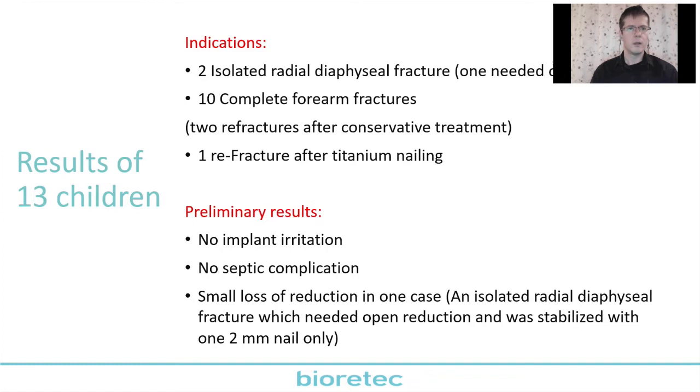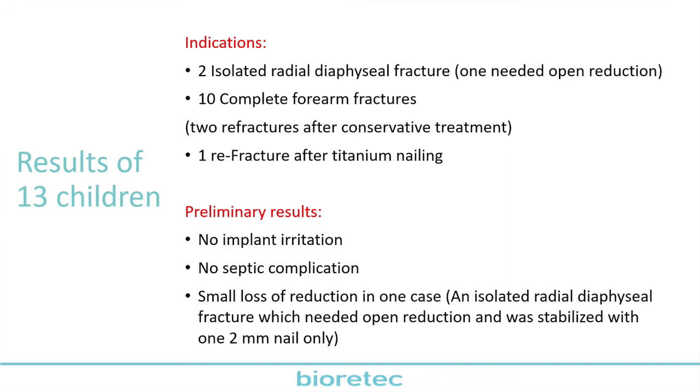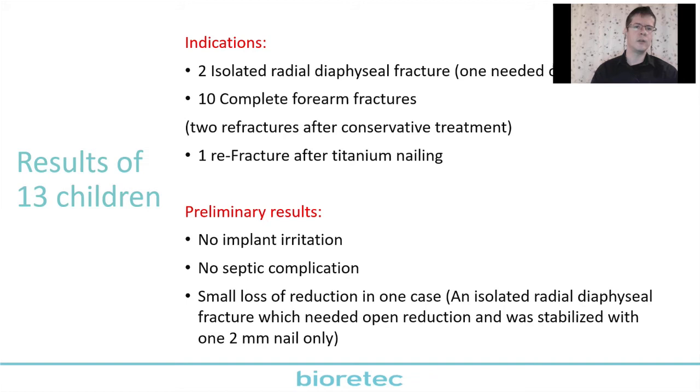And here we can see all the results. These are the first 13 children we have operated on with the Activa nail. We have seen only one very small complication. There was a small loss of reduction in one little girl. It was an isolated radial fracture, but the degree of displacement was under 10 degrees, and she is young, so we hope it will remodel with time.